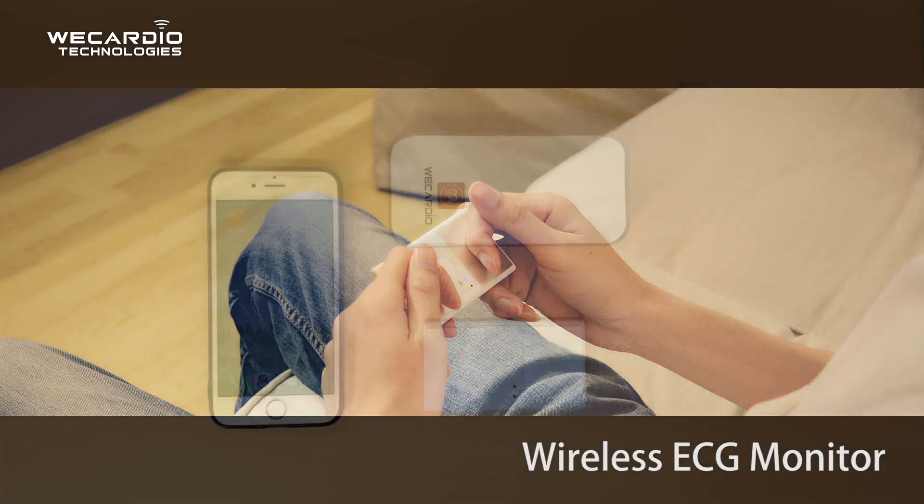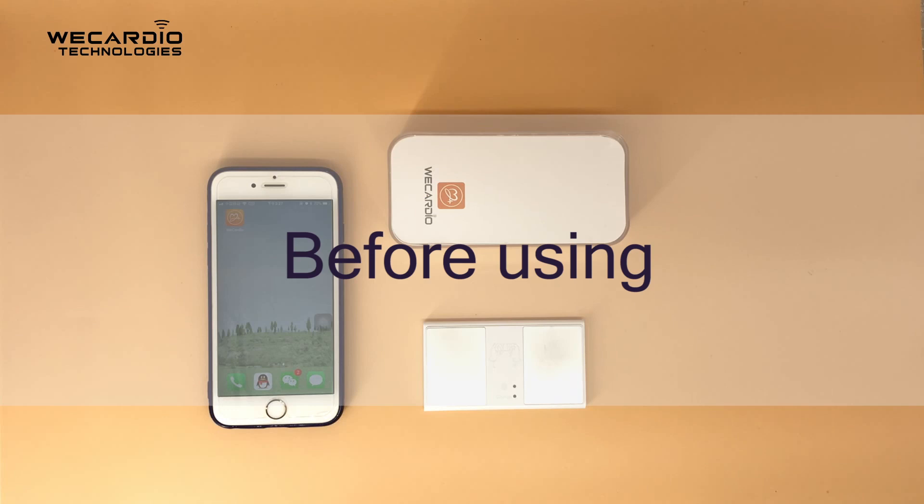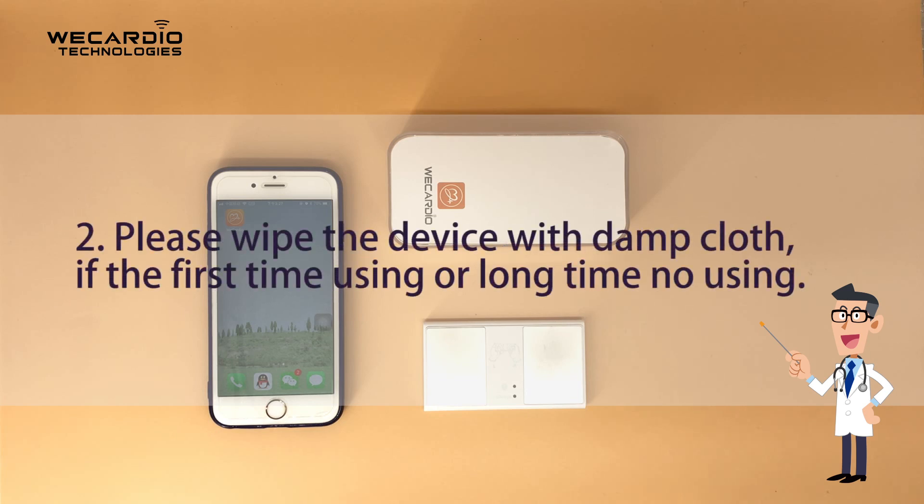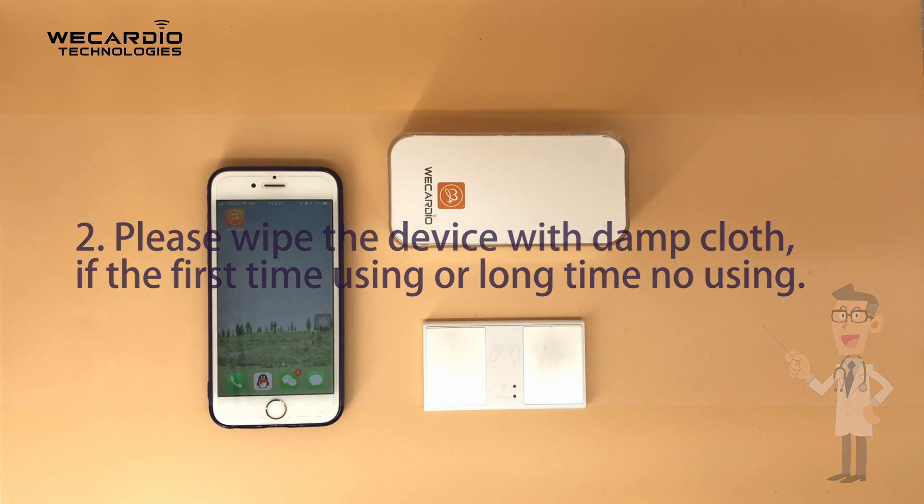Wireless ECG monitor. Before using: 1. Please wash your hands. 2. Please wipe the device with a damp cloth, if using for the first time or after a long period of non-use.